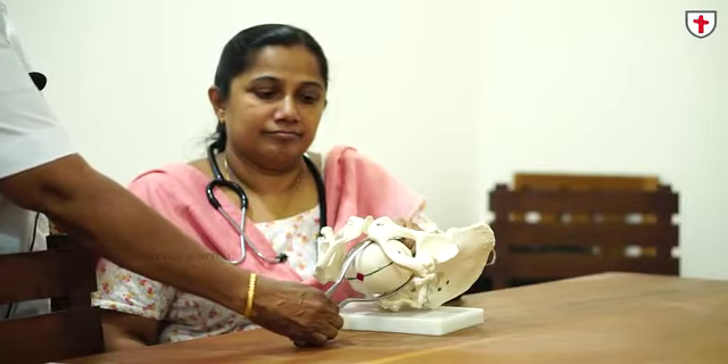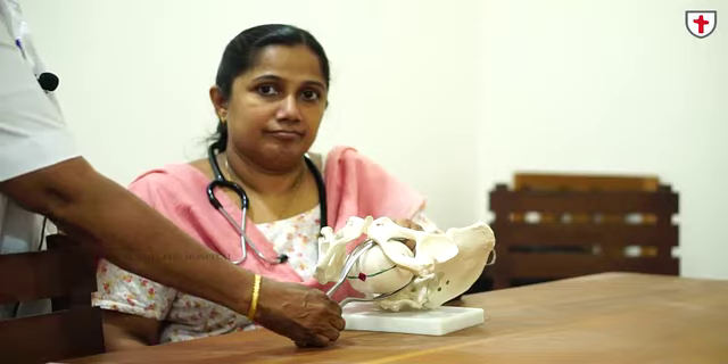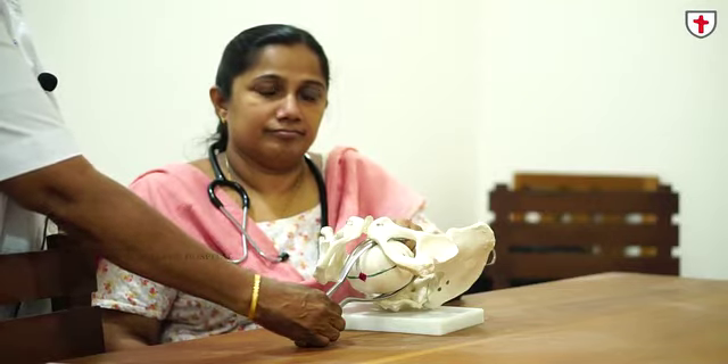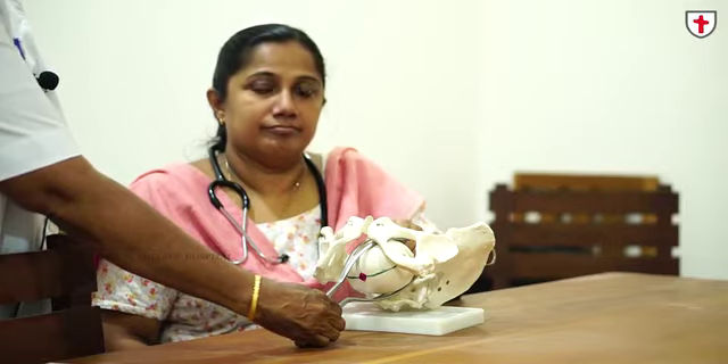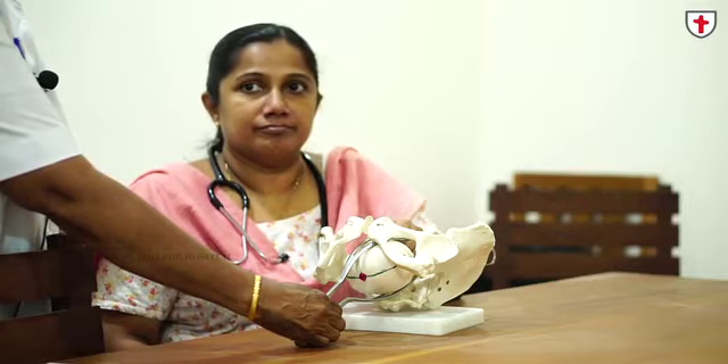The sagittal suture is in the transverse diameter. This is attempted only in deep transverse arrest without CPD, and in modern obstetrics nobody is practicing it because we have another alternative — vacuum extraction — which does auto-rotation. Just for theoretical purposes, we are showing this.